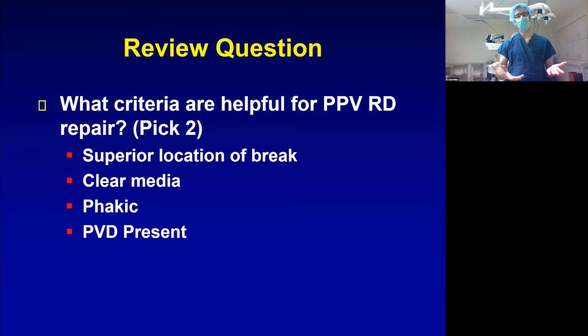What criteria are most helpful in terms of doing a vitrectomy for RD repair? I would say that in terms of success, what you'd like the most is a superior location of the break, because you need less patient cooperation with head positioning. Speaking of, I didn't discuss this, but Mike was already doing it. Robert's position can really be upright during the day, Mike, and then sleep on the, it was his left eye, correct? Sleep on his right side. So we're going to put him on his right side when he sleeps. The bubble tamponades the temporal breaks.